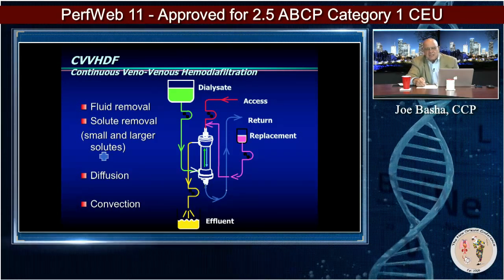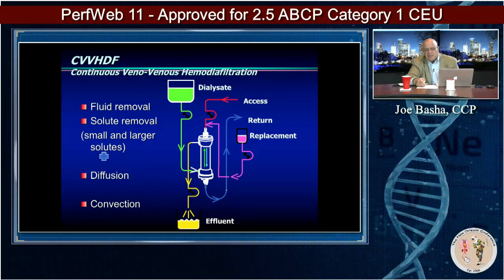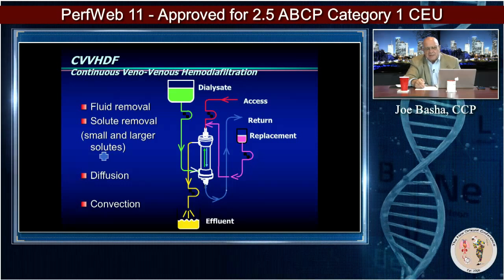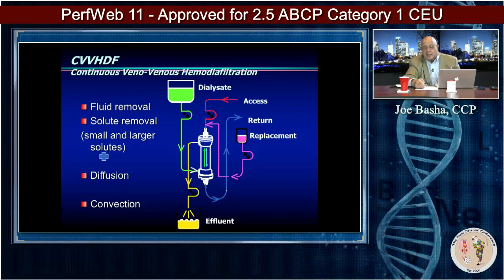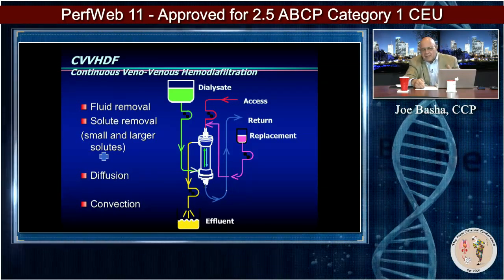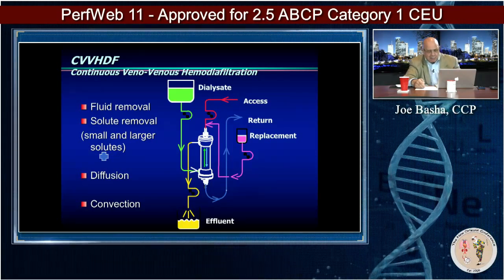I think if CVVH isn't going to work, CVVHDF, I think you can get everything done with CVVH. But CVVHDF is a therapeutic modality that does exist. And you're going to have both diffusive clearance and convective clearance, and it takes both small and larger molecules.